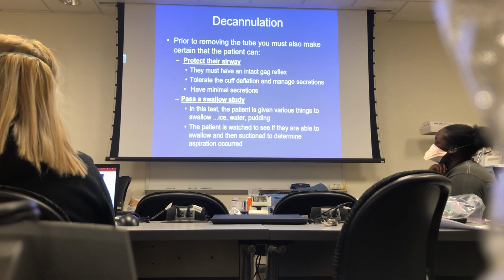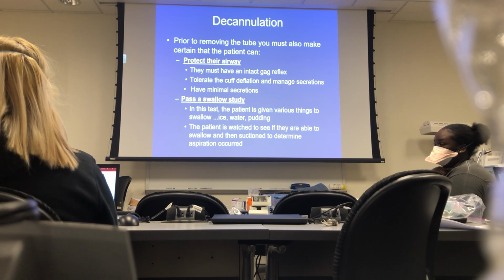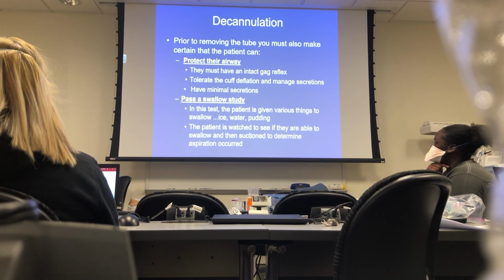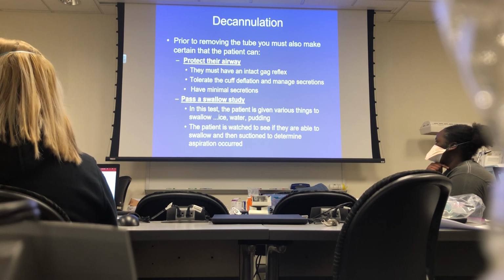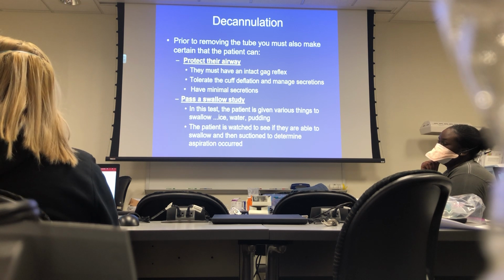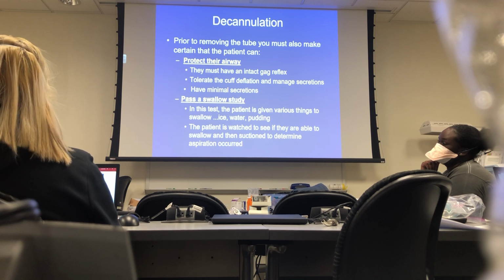This is bedside. First they'll start with ice chips. They'll give them ice chips and they'll see if they swallow. If they swallow and start coughing, are they aspirating the ice chips? If you give somebody ice chips in their mouth, the cuff is down, and you tell them to swallow, and then they start coughing, was the swallow mechanism working?